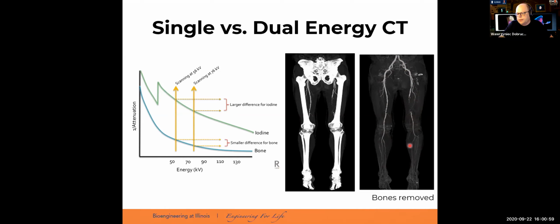Which may lead to an ischemic leg, or to some ulceration or maybe amputations if it is not fixed, right? So based on this image, the doctors can diagnose that this is an occluded vessel, and it requires either a vascular catheter placed to maybe clean the occlusion over here, or placement of a so-called bypass. So surgical implantation of vessels which will bypass this occlusion and provide blood and nutrients to the lower extremity. So this is the dual energy.